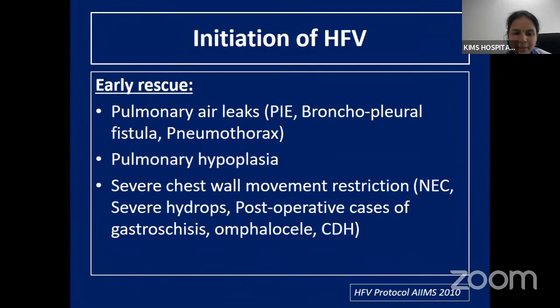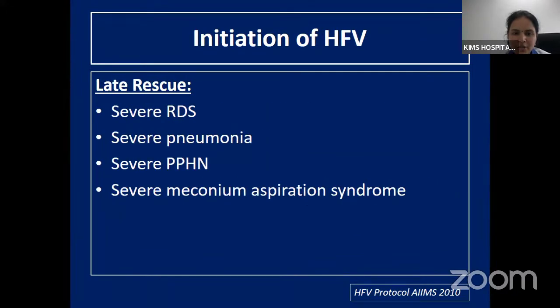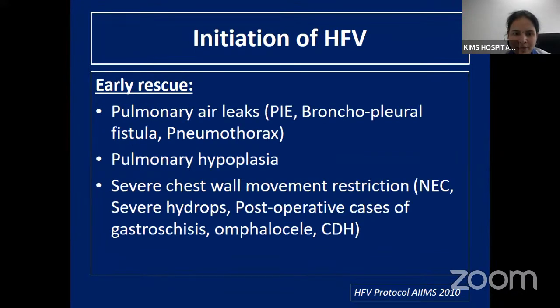So there are 3 types of indications of initiation of high frequency ventilation. I shall not be touching upon the prophylactic usage of high frequency ventilation because this is not something that is recommended based on scientific evidence. We will only talk about the early rescue and late rescue initiation of high frequency ventilation.